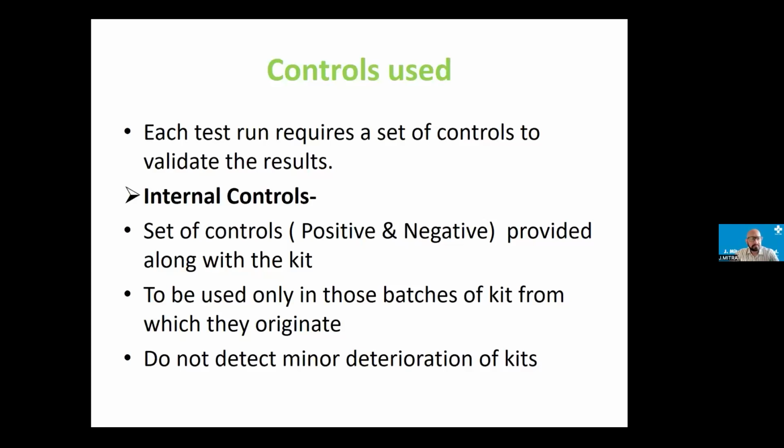When the value ranges between 1 to 50, I am talking about hepatitis B or HIV, we have done a study on HIV where we found that when the CLIA value comes within 0 to 50, that is a positive according to CLIA. But when we repeat the test with NAT, it comes out as negative.